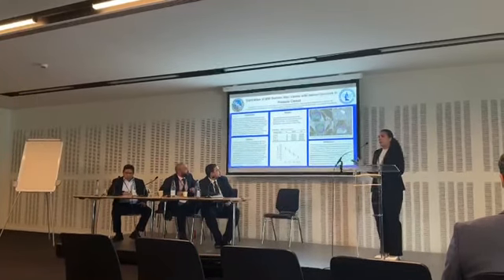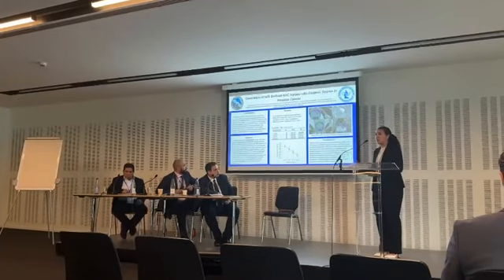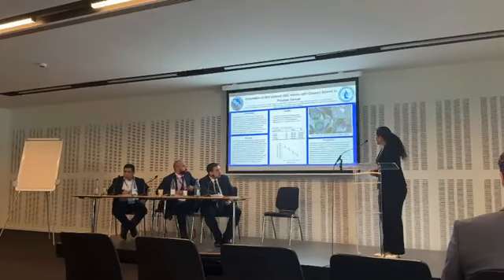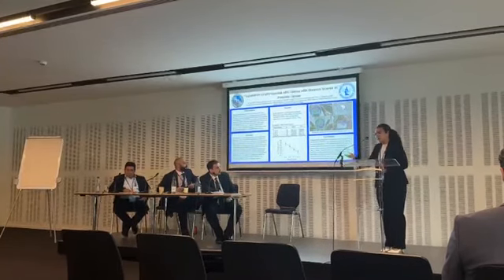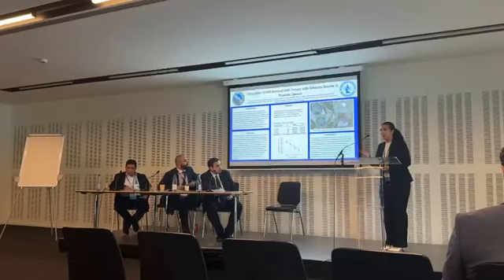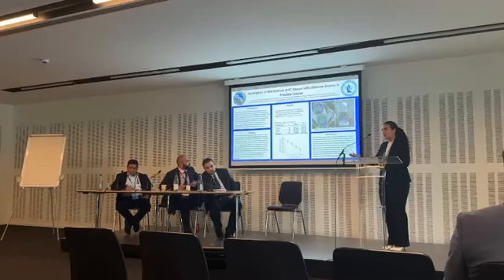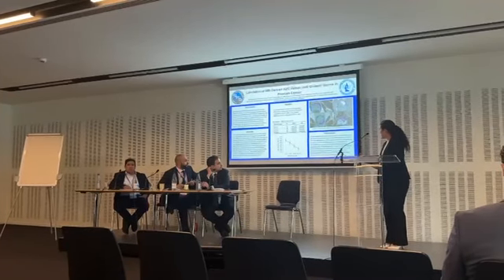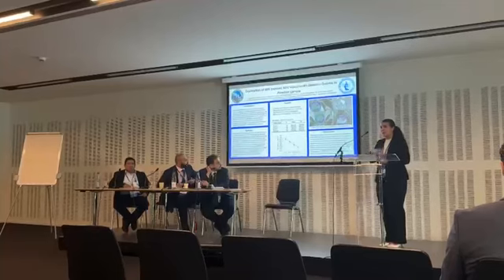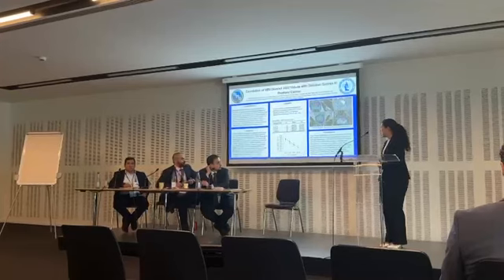This finding is so important because it can serve as a non-invasive biomarker to assess tumor aggressiveness. And not to mention, anybody can learn to read these MRIs, trace the prostate, and then find the minimum ADC at no cost to the patient or to you. You can find any free software. We use our MIM software. Other findings have validated these as well. They support it, and we also need future studies to further validate these findings.